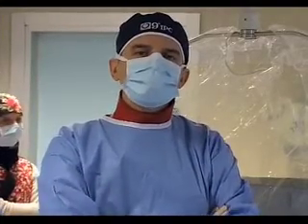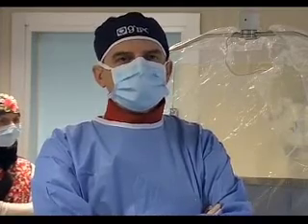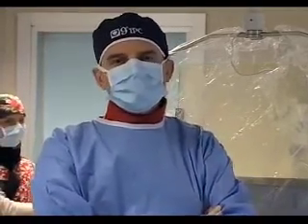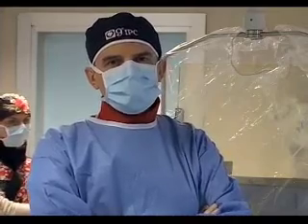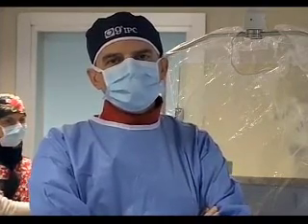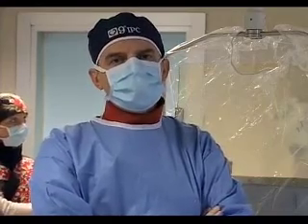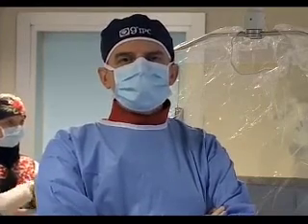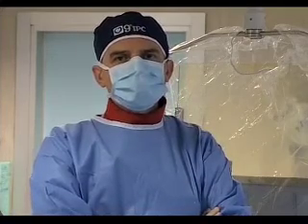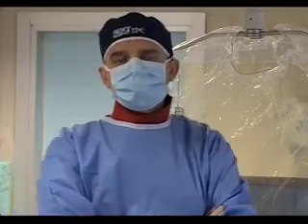We are thinking about implanting a covered stent, and we decided on a covered stent for many reasons. First of all, the diameter of the isthmus. We don't like to dilate this kind of coarctation with just a balloon, since for a long time now, in our experience, the incidence of wall injuries has been related to balloon angioplasty or bare metal stents.